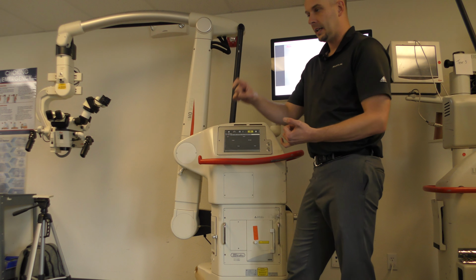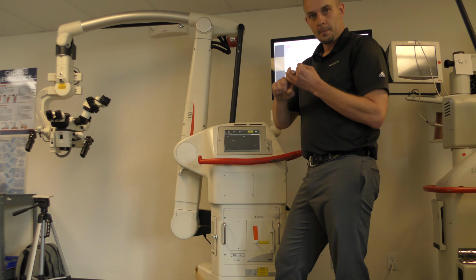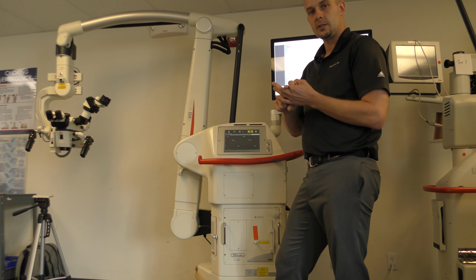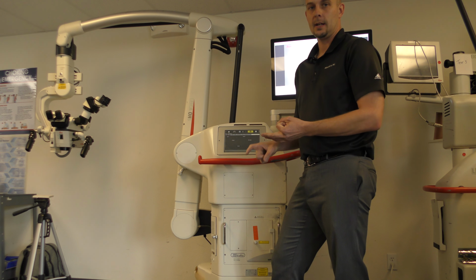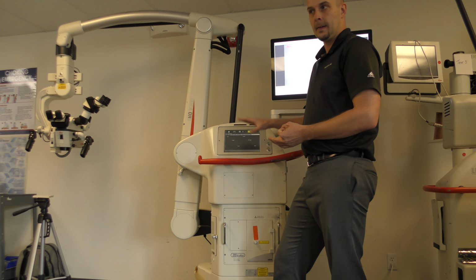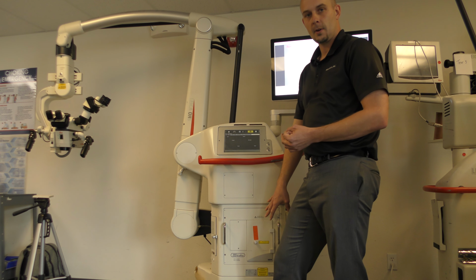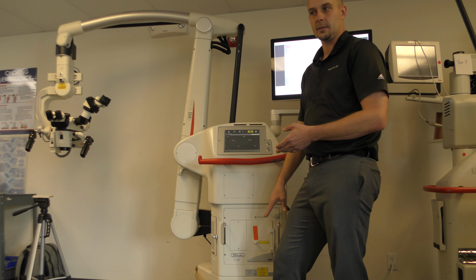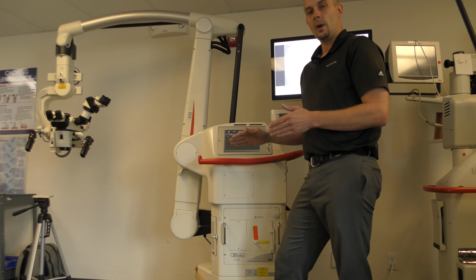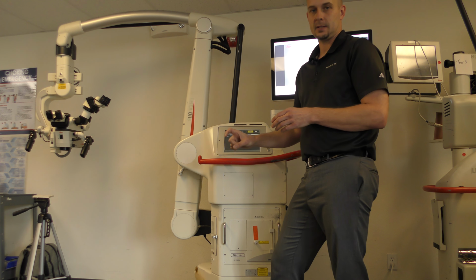The way that I explain it in the text of the service report is I say, the bulbs are rated for 500 hours. They have to be replaced consistently in order to maintain the integrity of the power supply. There are discrepancies between the hour counts of the bulb timer and the database, there's dust inside the heat sinks of the bulb modules, and there are burn marks in the reflectors. I make sure that I lay all of that out, line by line, so that Biomed has a very clear and distinct understanding of what the expectation is.